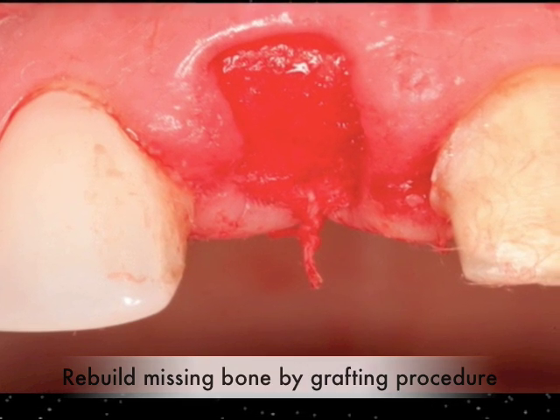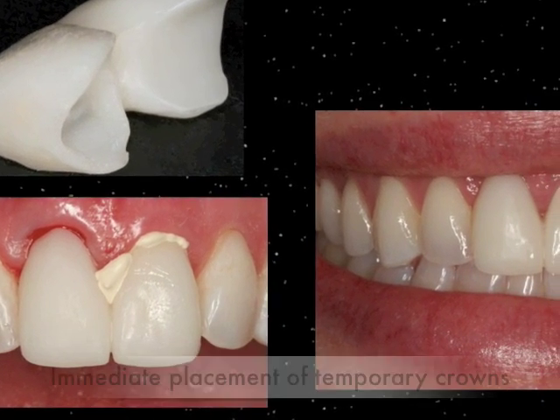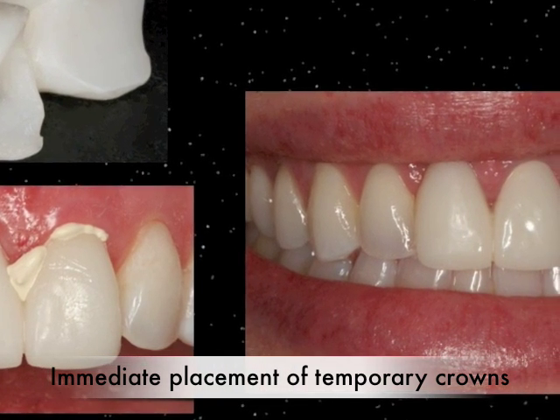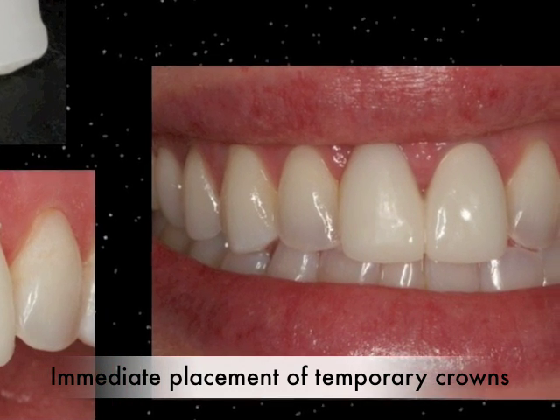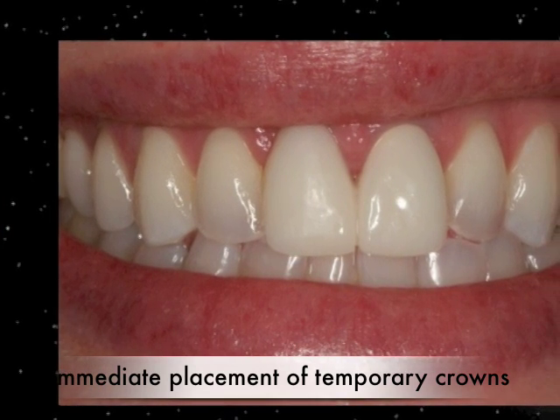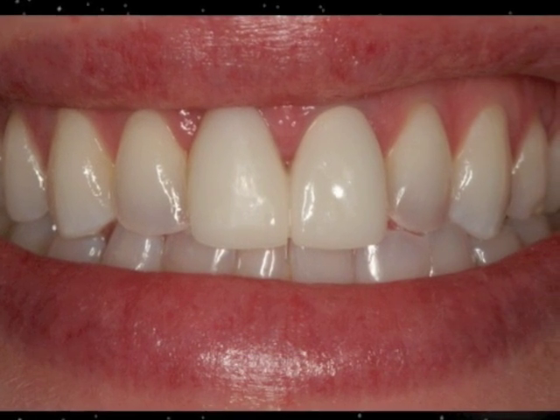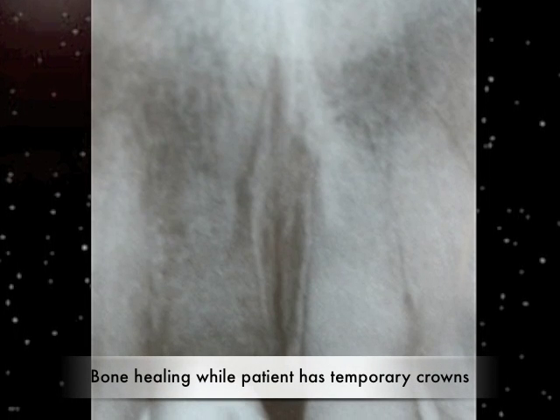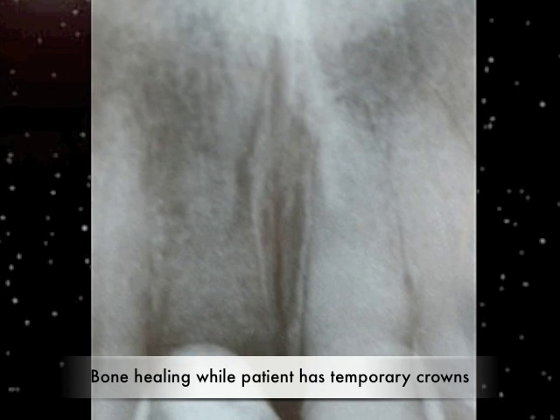The reason why we have this provisional made before the surgical site is so that we can immediately place the temporary into the surgical site and onto the adjacent tooth for support, providing an immediate fixed restoration that's comfortable and natural-looking for the patient while we allow the bone to graft and grow into the site and allow for eventual implant placement.